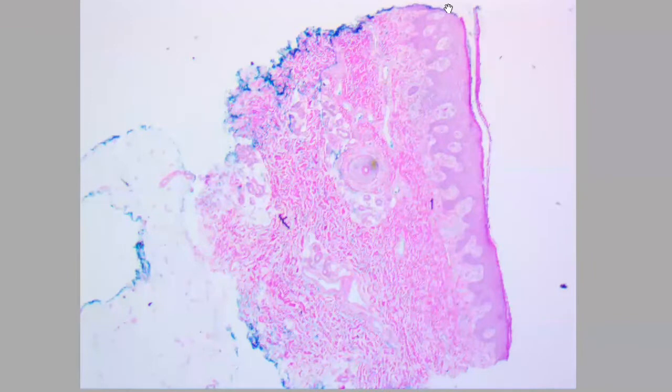For the microscopic features of psoriasis, it depends on the stage of the disease, whether it's recent or old. Another thing, I will explain some features at low power, and some other features we need to go to higher power to mention. So at lower power, we just need to see that we have increased epidermal cell proliferation, as you can see in this area, and maybe in this area.